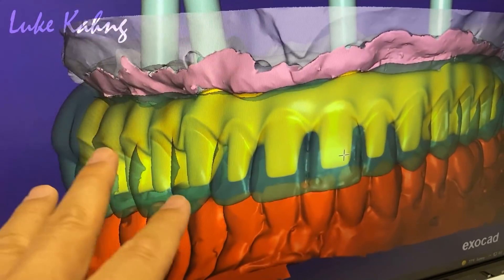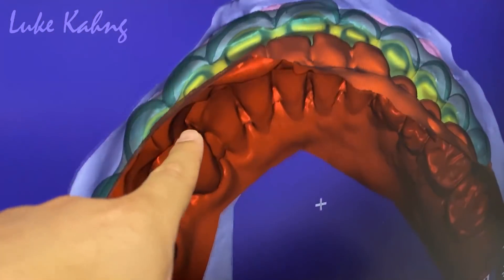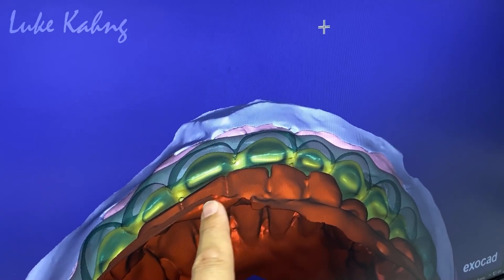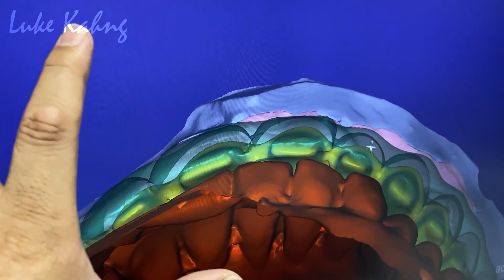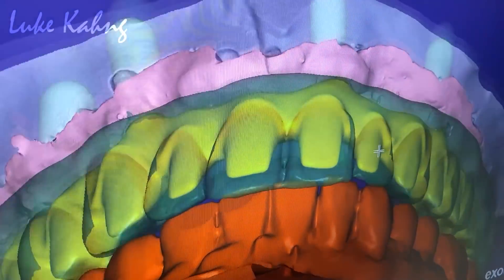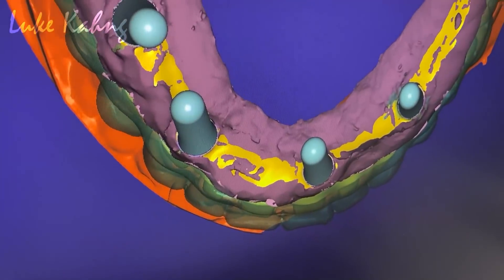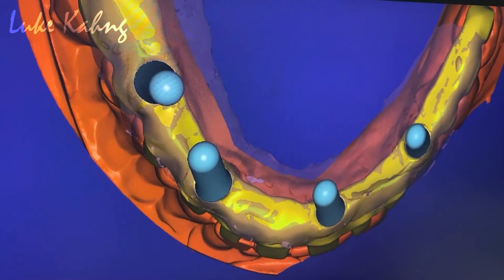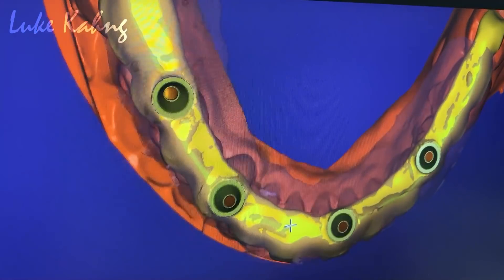Now the size looks good in the occlusion view. I like the two-millimeter facial thickness. That's good because this is chrome cobalt metal underneath the pontic. Now we're going to touch the metal. Half-tenth millimeter pushing the gum, so we're going to polish it underneath.